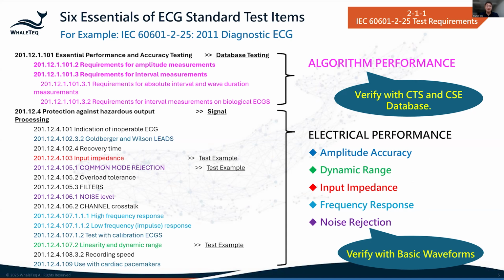And input impedance, which defines your system's sensitivity. We test this to verify the ECG machine presents a sufficient load. We need to ensure it can couple the weak physiological signal from the patient to your analog front end as completely as possible.